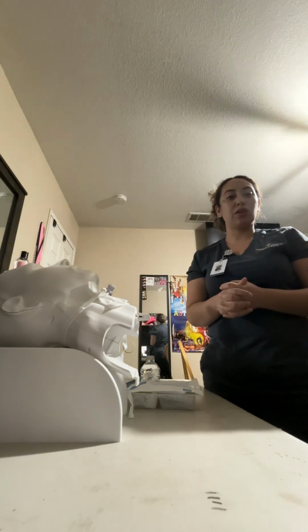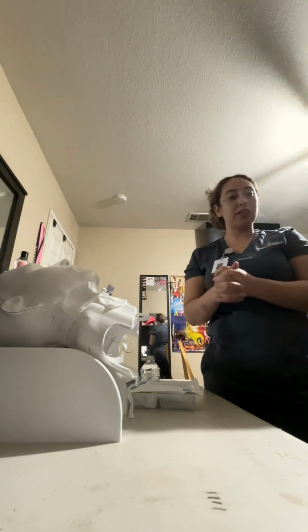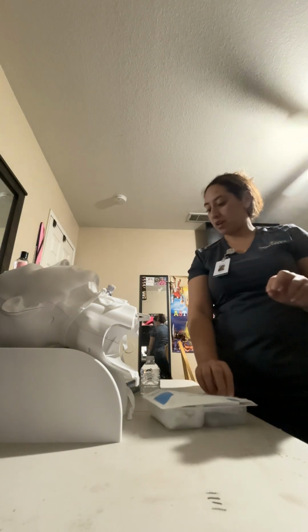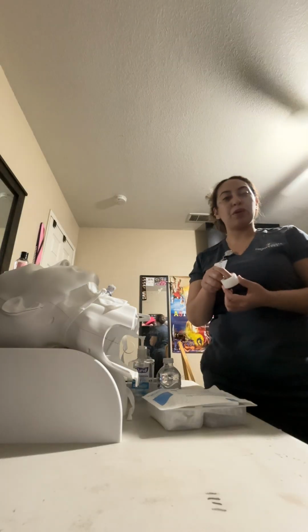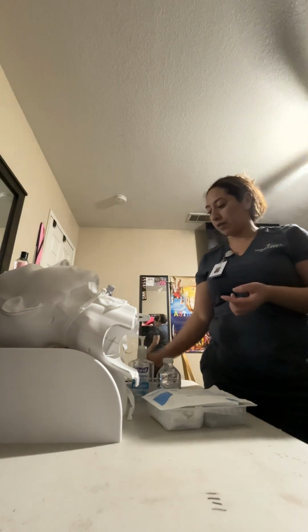For this video, I have already gathered some supplies that I'm going to need. These supplies are going to be a tracheostomy clean and care tray. I also have the cleaning solution as ordered. I have my hand sanitizer here ready to go. I have some clean gloves and I have some tape that I may need later.